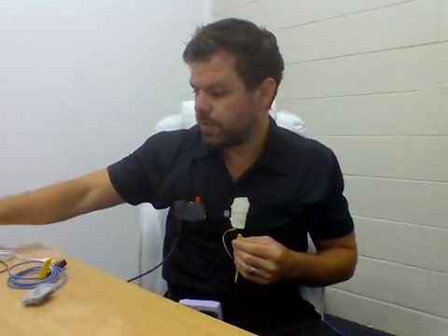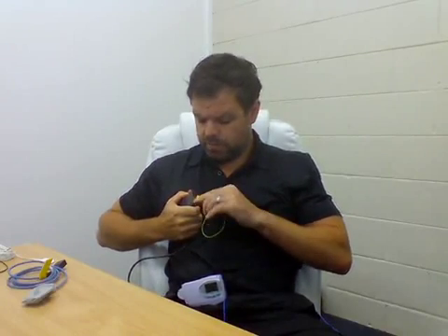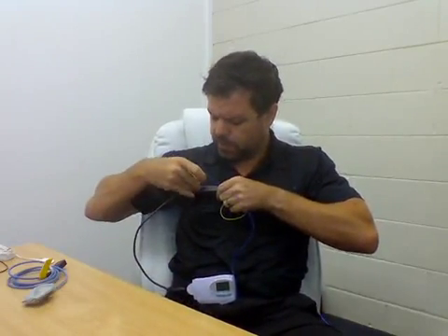And now we're basically set up, and all we have to do now is start plugging everything into this input box. So that's step number 3, just attaching the yellow and blue cables from the thoracic bands. So we just get that yellow cable. It does tell you in the booklet where they go, but you can simply look and find the actual spot that's yellow that has the keyhole shape and plug it in. Pick up the blue cable from the abdomen band, same thing, just find the blue one where the same shape is, and now that's in there, and we're ready to go.